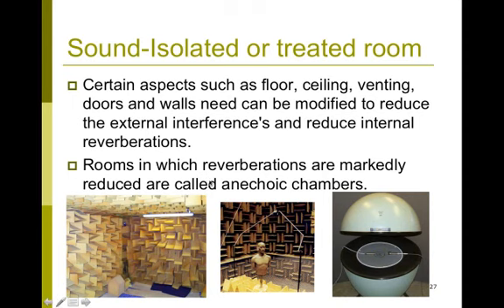Some clinics might have small anechoic chambers specifically to test hearing aids. But a large anechoic chamber is rarely seen and needed for just clinical audiology.